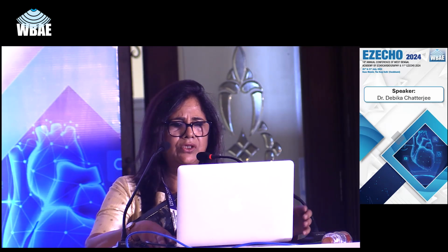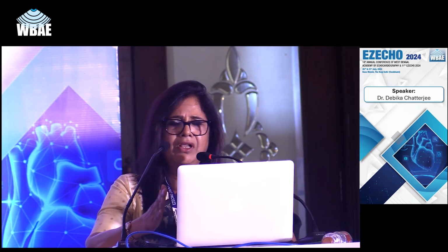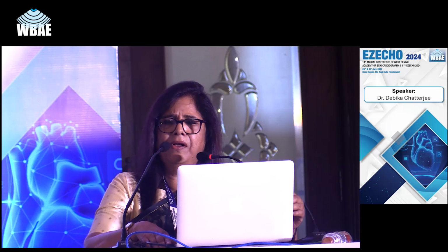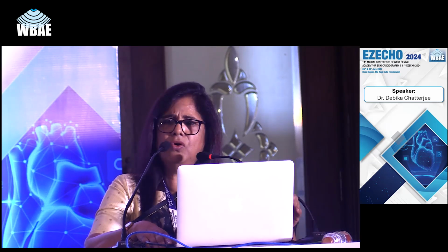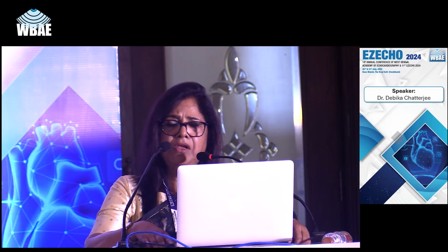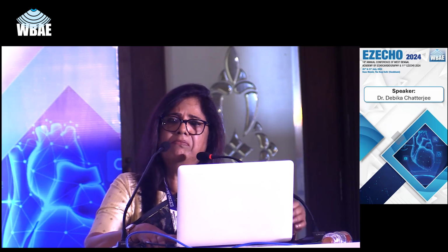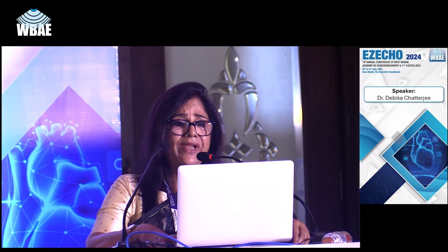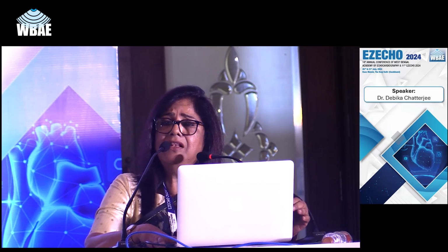This is the 4 chamber view. You see the walls are kissing each other, smallish LV, smallish RV, very small IVC. So there's no doubt that this patient needs fluid replacement. But before replacement, do we want some more information other than these 2-dimensional pictures? Yes, of course, we need to know the LVOT-VTI.